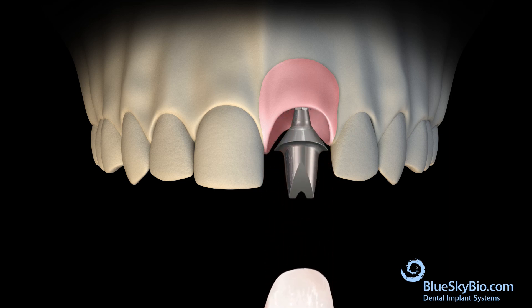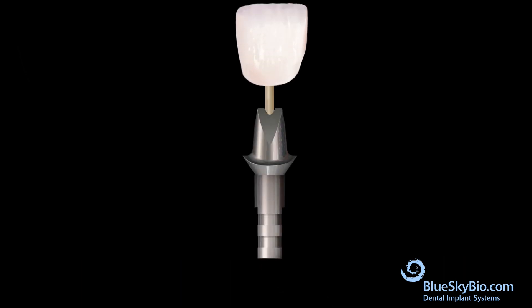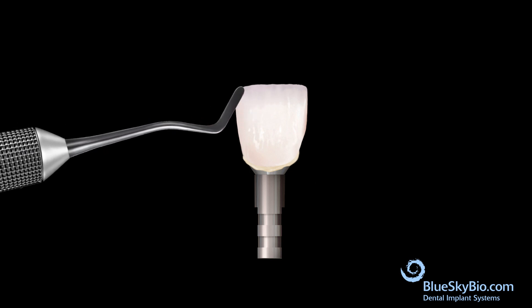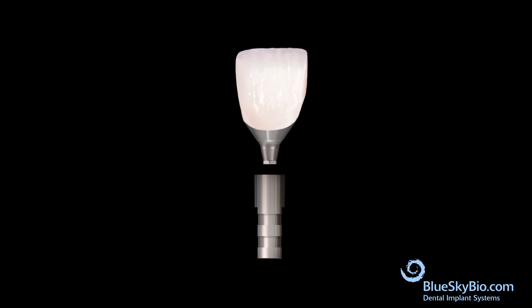Remove the crown and abutment and place the abutment onto an analog. Place a wood end of a cotton tip applicator into the screw channel to keep it protected. Apply bonding material to the crown. Remove the wood stick and bond the crown to the abutment. Remove the excess bonding material from the screw access hole and the crown margin.